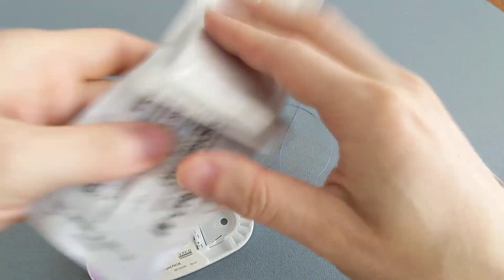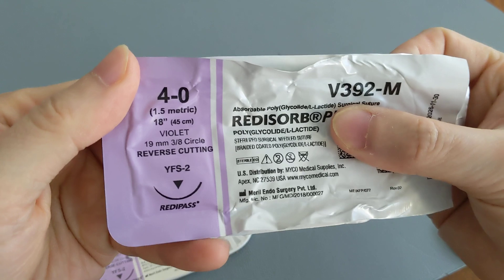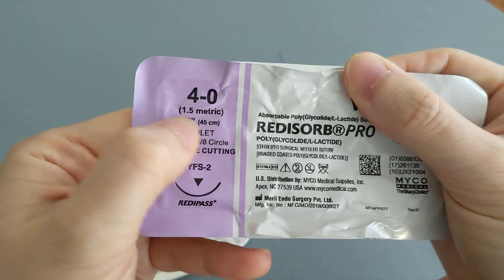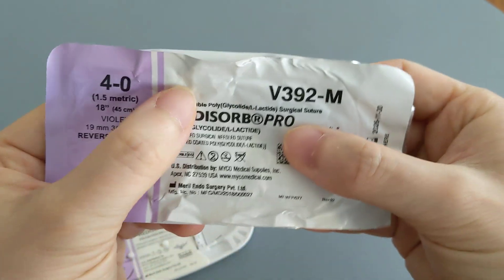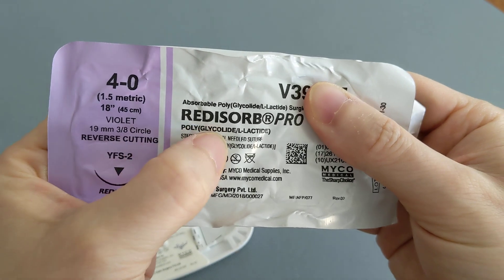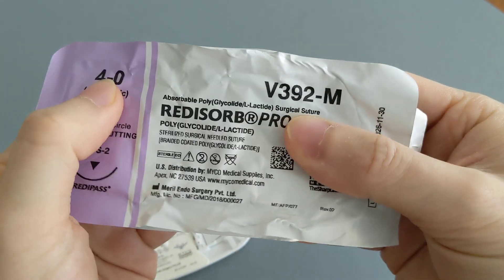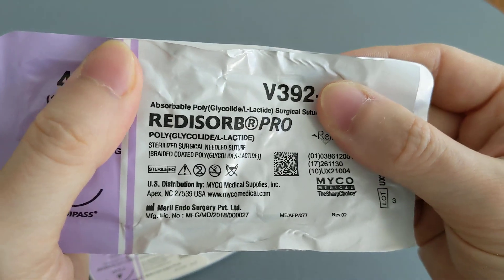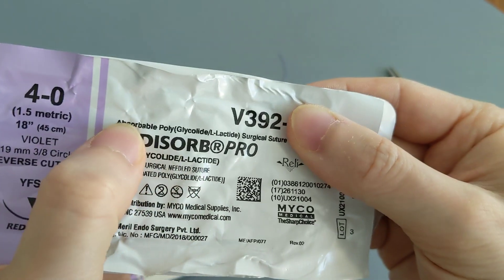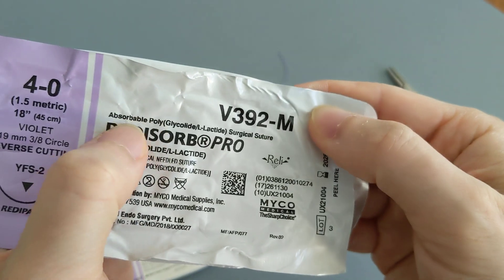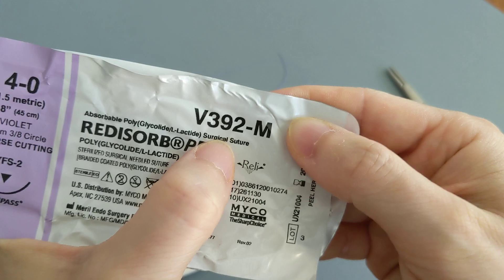All right, so let's see what it's made out of. Even on the packaging it says violet, and it is polyglycolide, so it's a PGA suture material and it is absorbable. Absorbable polyglycolide surgical suture.